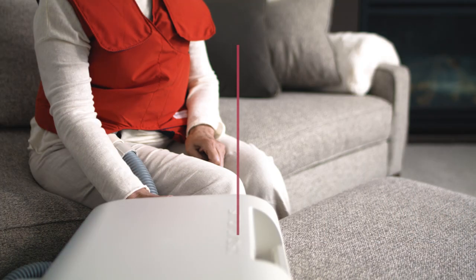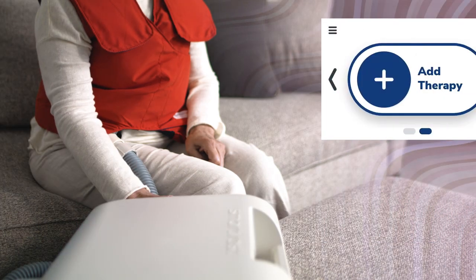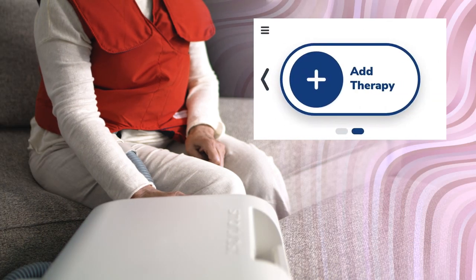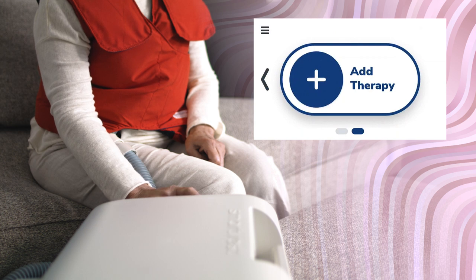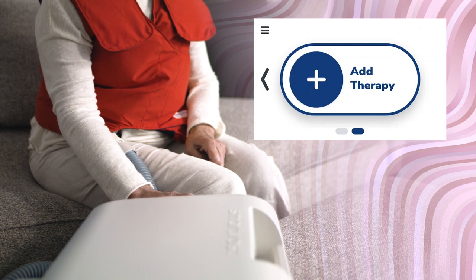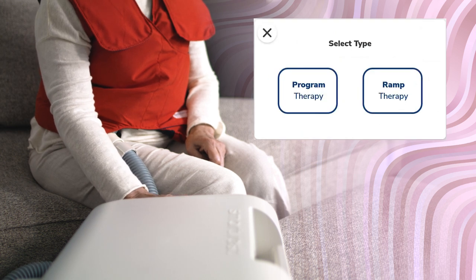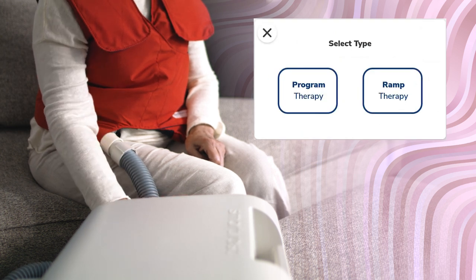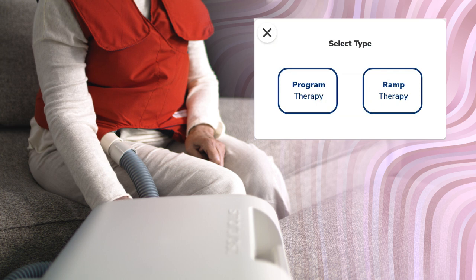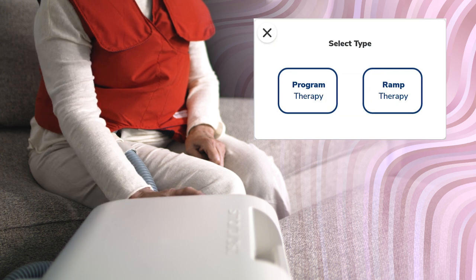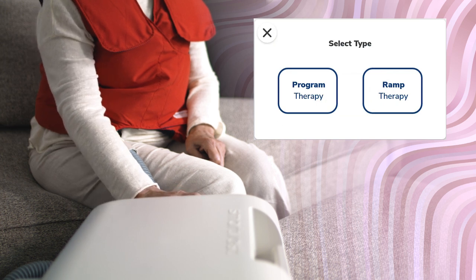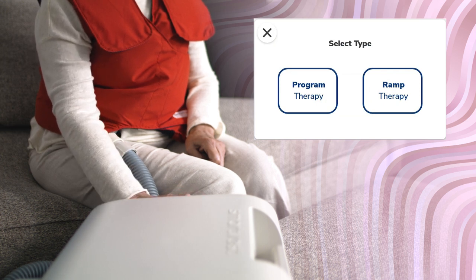To program a new therapy, navigate to the home screen. Then scroll to and tap the Add Therapy button. Tap the Program Therapy option to customize a new program therapy. For instructions on programming a ramp therapy, see the ramp therapy video.